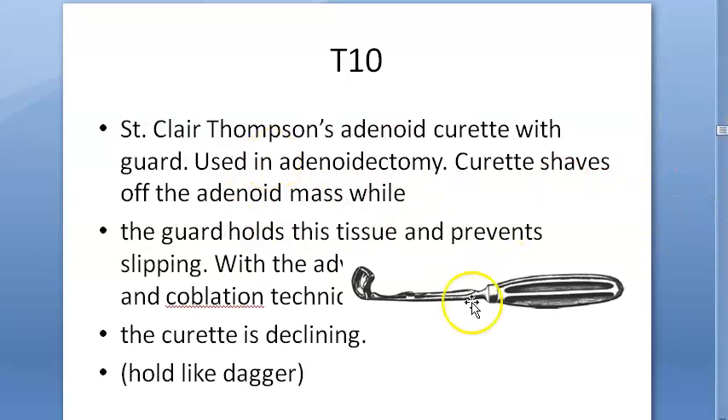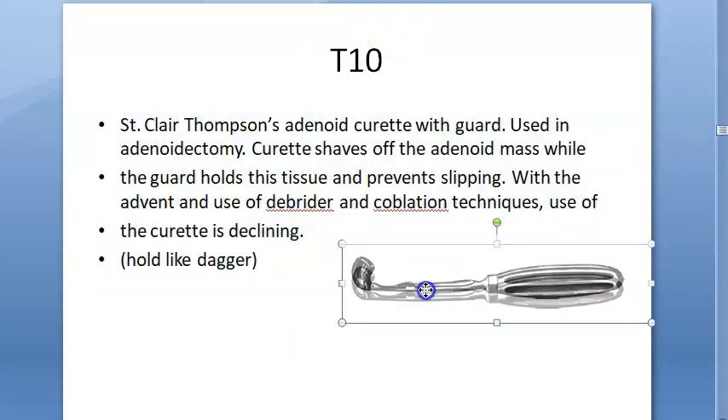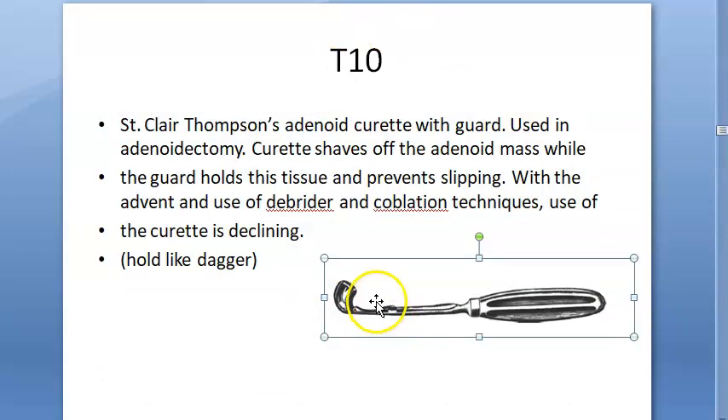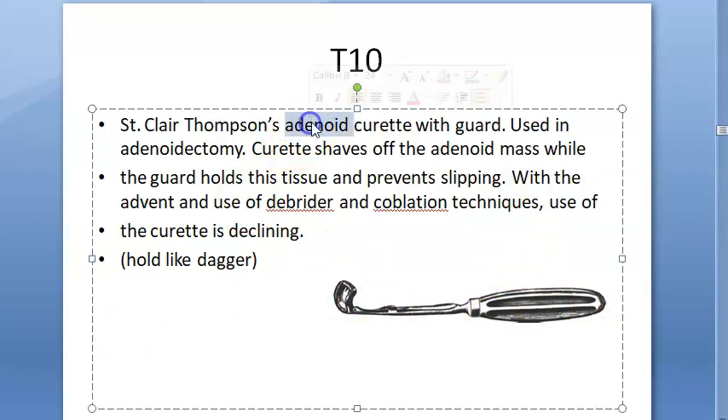Here you have the adenoid curette, so we are now talking about adenoidectomy. You hold it like a dagger, put it in, and pull out — kind of scoop out the adenoid. This is the adenoid curette with guard; you can also get it without guard.